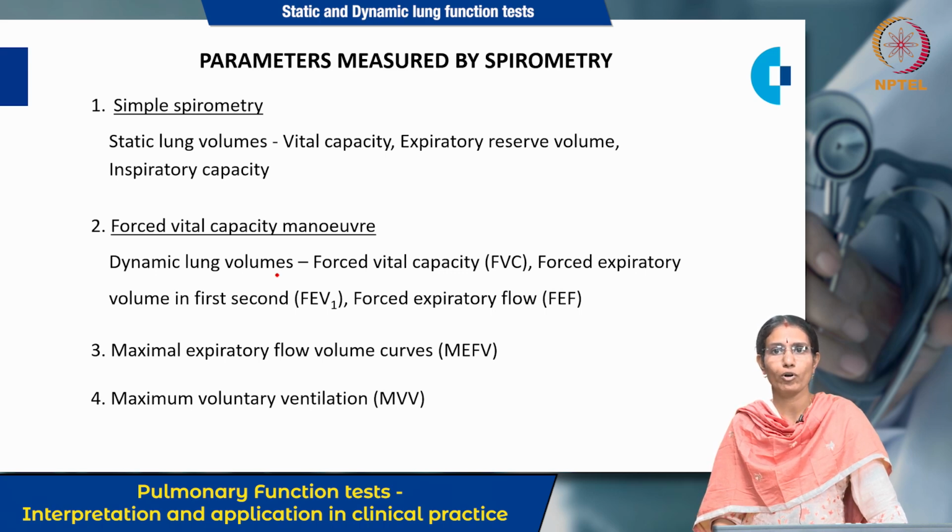We also saw the flow volume curves, the peak expiratory flow rate and how it is measured, and maximum voluntary ventilation and its clinical application. So all these are the parameters measured using spirometry.